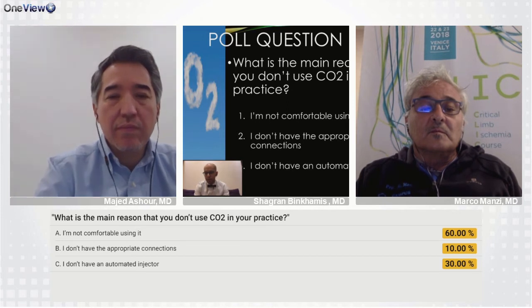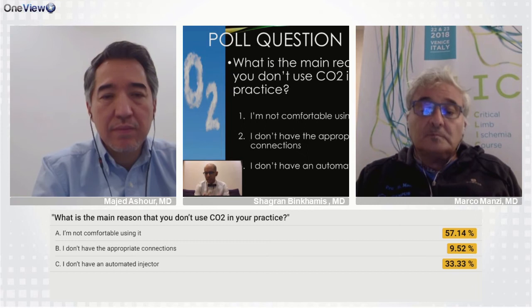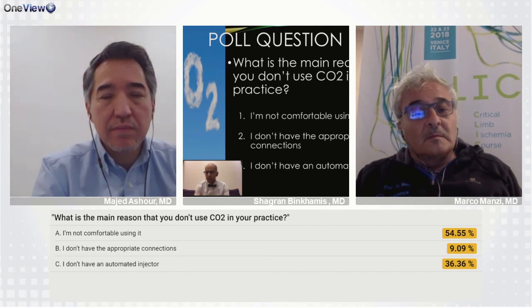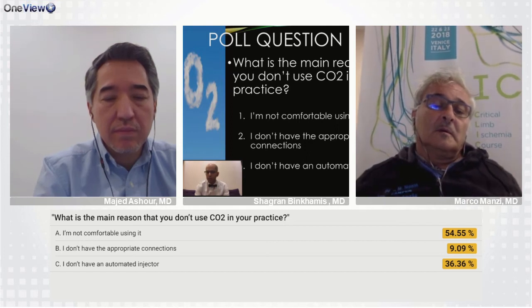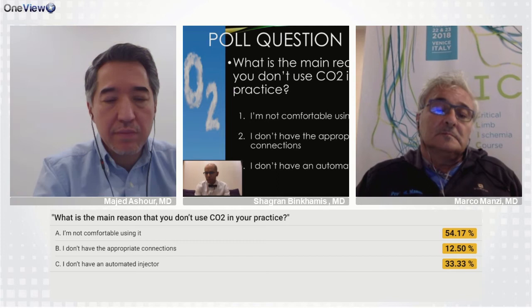Or they refer patients to us and say, oh, we don't have an injector, which to be honest is not really a good answer in my opinion, or probably even the company's opinion, because the injector is a facilitator to making you use CO2 easier, but it doesn't mean that if you don't have an injector you cannot use CO2. I think the most appropriate answer should be that you're not comfortable using it.